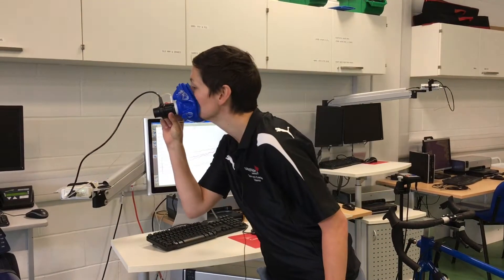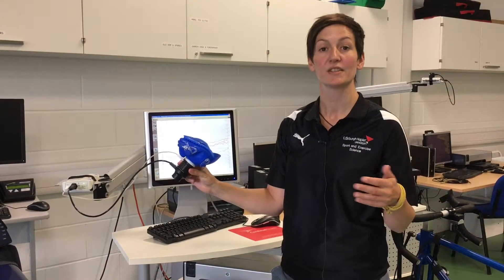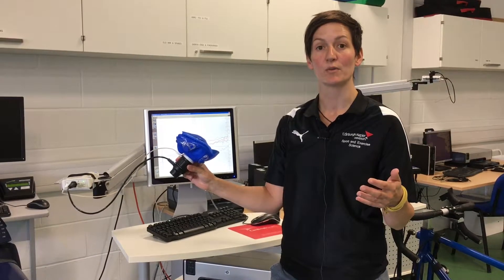When performing a VO2 Max test, we use a mask like this and place it on the mouth. What that does is record all the oxygen and carbon dioxide that we're breathing out, as well as the volume. It allows us to see how efficient a person is while they're exercising.